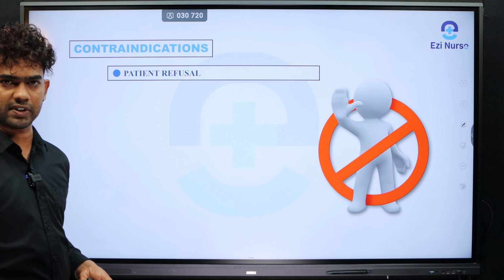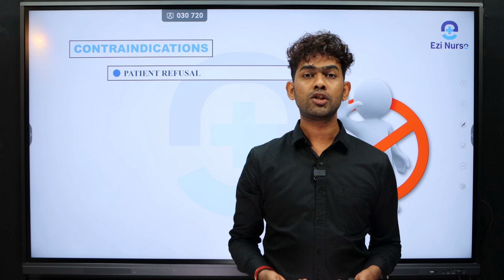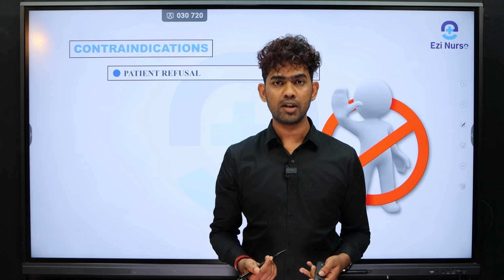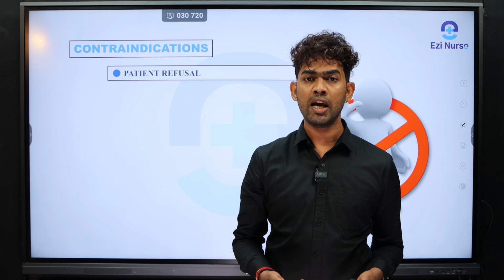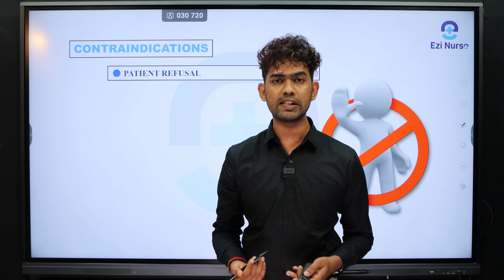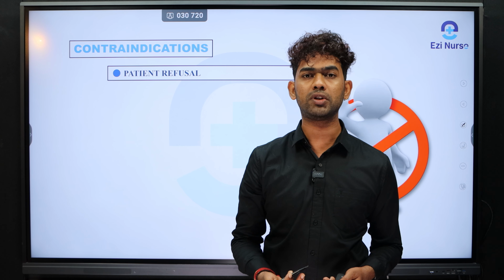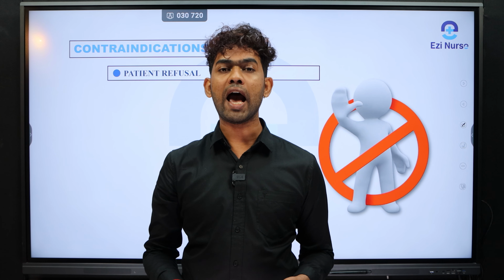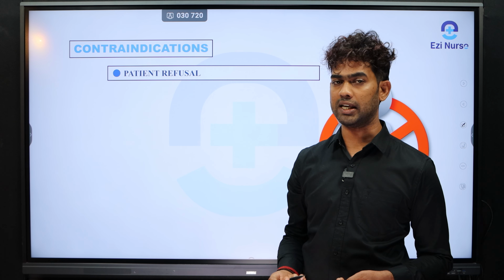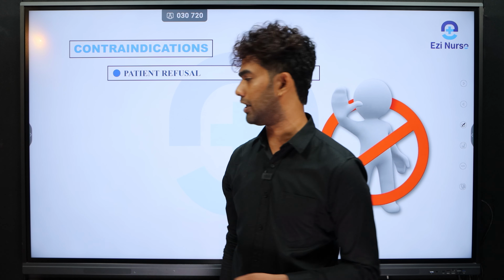The patient refusal. Sometimes the patient may refuse to take the ECG. So we should respect the patient. For every procedure we should take consent before the procedure. If the patient is refusing the ECG, you should inform the patient in a polite way about the purpose and indications for taking the ECG, and convince them to take the ECG. That is important here if the patient is refusing the ECG.